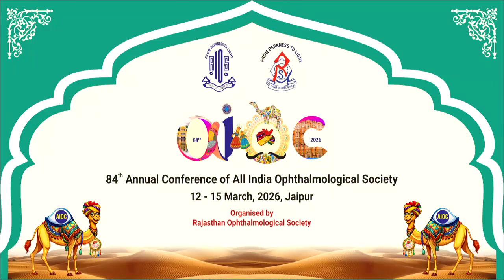Thank you. That's a very nice video, and the struggle was a lot. Yeah. So, knowing that the corneal endothelium was already compromised, why didn't you think of doing what you did at the last, at the very beginning?